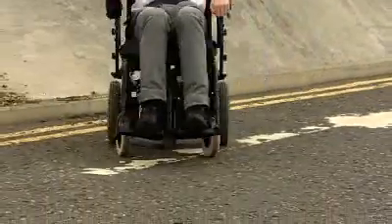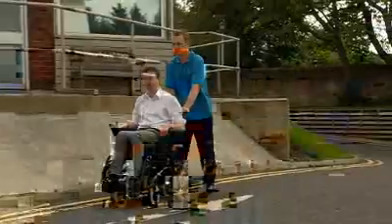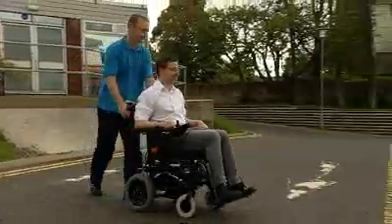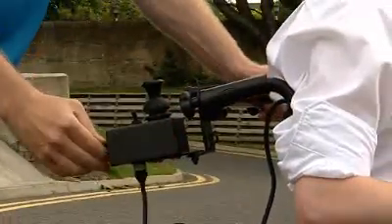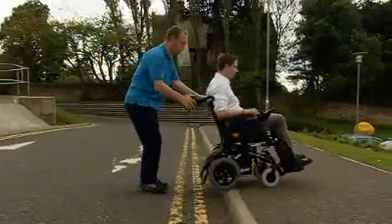If the wheelchair is fitted with a curb climber, then the wheelchair is capable of climbing curbs. To climb curbs, you should have a firm grip of the wheelchair, approach the curb slowly ensuring the wheels are straight on. Shortly before the front wheels or curb climber touch the curb, increase the speed and reduce only after the rear wheels have climbed the curb.